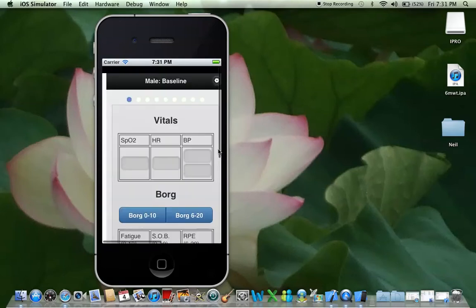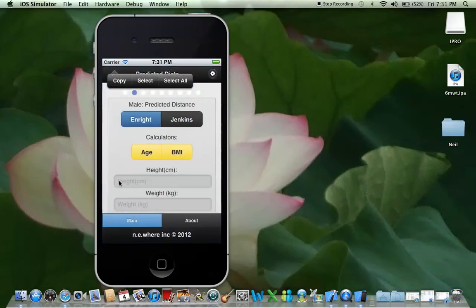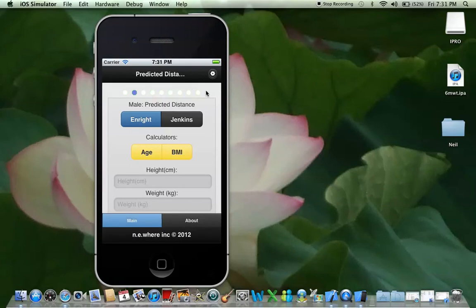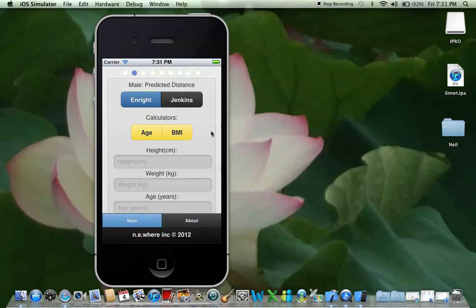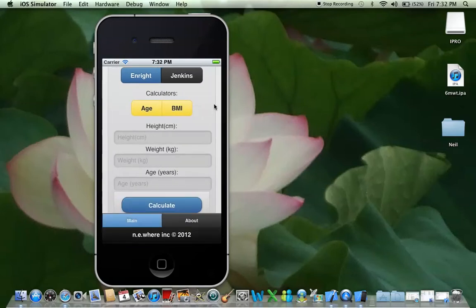So you've done your vital signs — let's go to the next page. This is where you do your biometrics: you've measured the client's height, weight, and age.